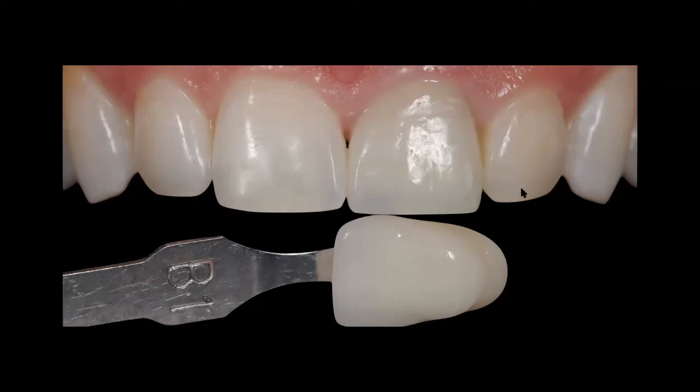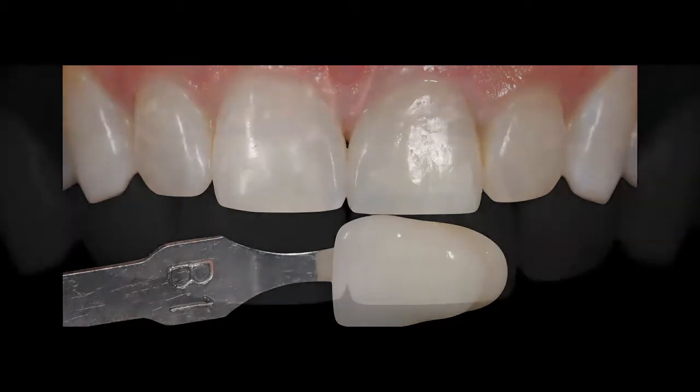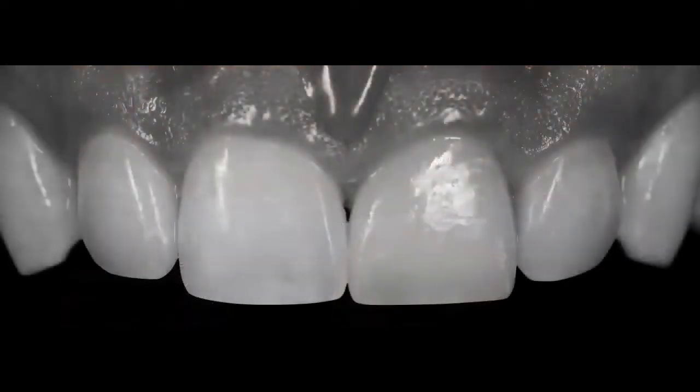And I think that here you can see a little more clearly the difference in shade between this lateral incisor and this central incisor. This is a little bit darker than this. This is the patient's natural dentition, and there are no issues with this lateral incisor here. This is just the natural shade of that lateral incisor. So again, this is why these cases can become somewhat complex. Now what I'm doing here is taking the color out of the photo to evaluate the actual value of the tooth, high or low value. And you can see that we needed higher value.